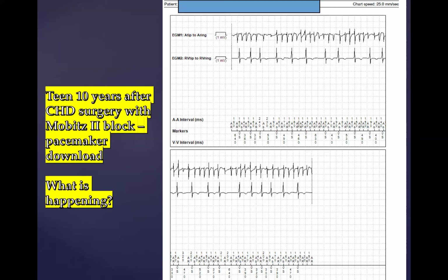And this was done, for the sake of this little story we're making, let's say on Saturday. Because on the weekends, we don't check them unless a patient calls us. So this is not uncommon, right? Jack will come in on Monday because he checks it every day, and he'll see a download from 2 days ago after he left for the weekend. And this is the tracing.